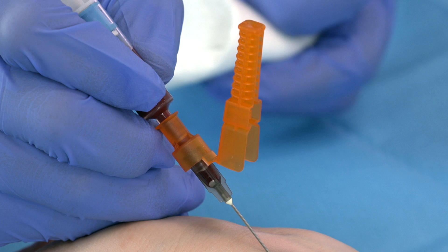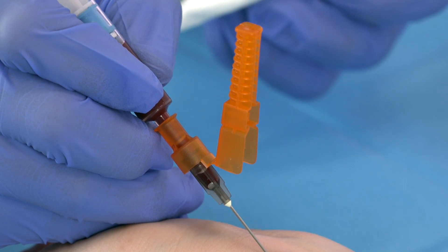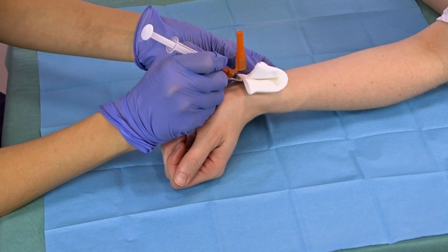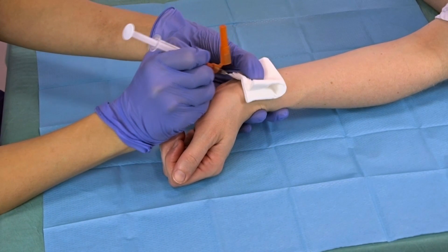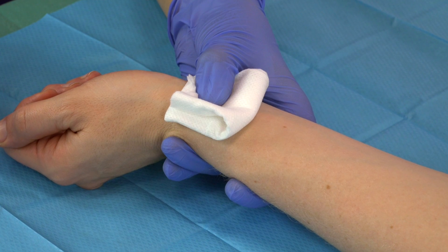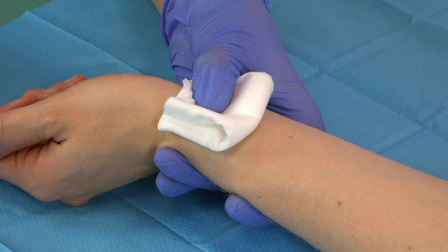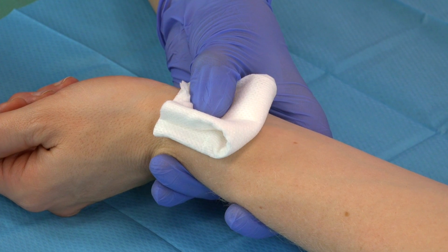So, gently withdraw the needle a small amount, and the syringe should begin to fill. Once the syringe is completely filled, withdraw the needle completely, and immediately apply pressure over the puncture site using the sterile gauze. Pressure should be applied for a minimum of one minute, but this may require as long as five minutes, particularly in patients with coagulopathies or those who are on medications that affect their ability to clot.